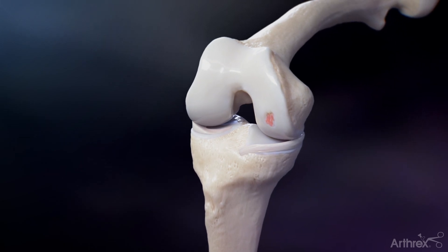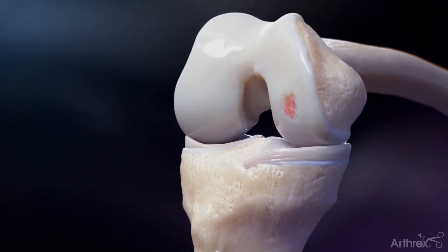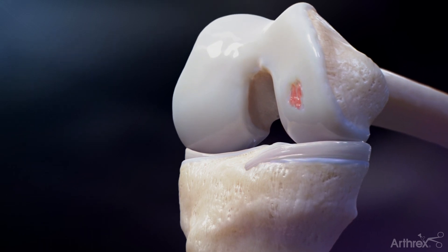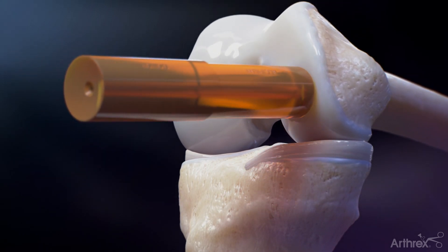Following preoperative examination to confirm the size of the lesion, perform a standard peripatellar arthrotomy to expose the defect. Select the appropriate cannulated allograft OATS sizer to estimate and approximate coverage of the lesion.